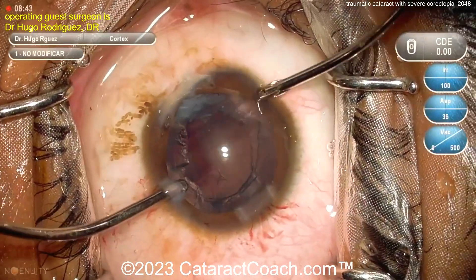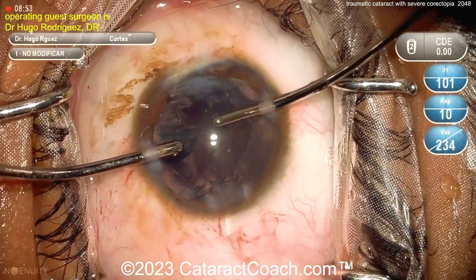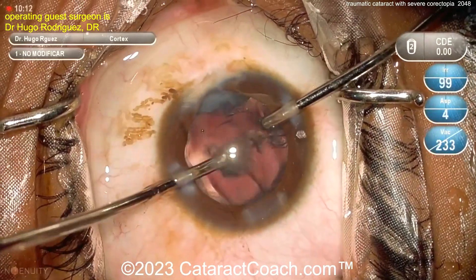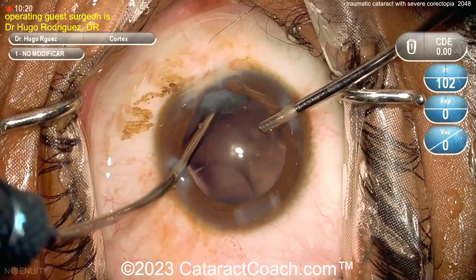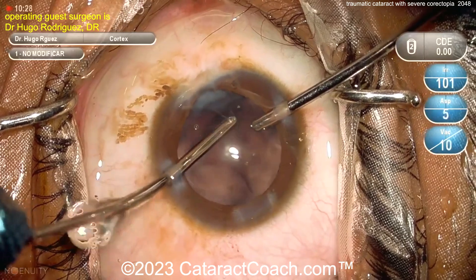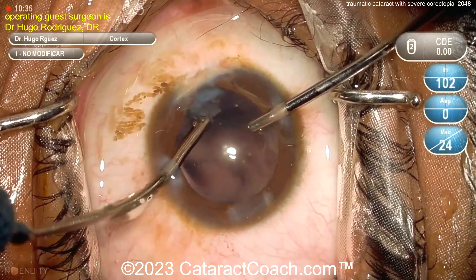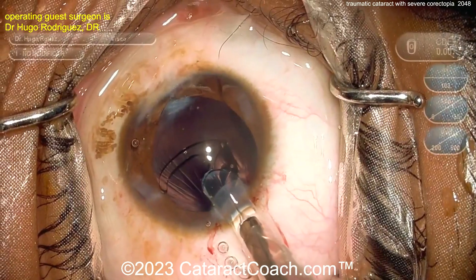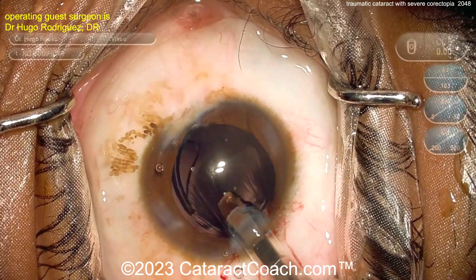Now here comes bimanual cortex removal. The approach is to take out most of the cortex first, then address the one area near the trauma site last. That looks pretty clean. Being very cautious at that last area because there could be damage to the capsule, damage to the zonular support, and vitreous could prolapse — but it looks pretty good.